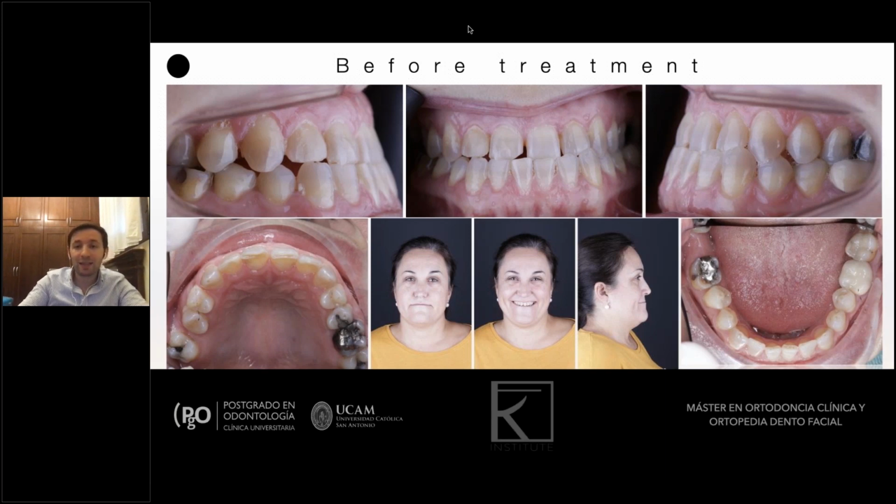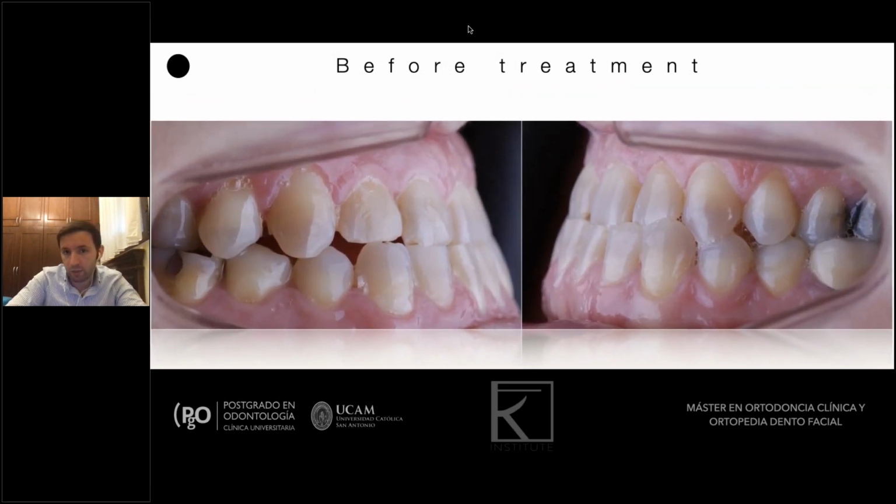We made the intraoral scan, and they said, Perry, I cannot put veneers here because I need an overjet. So it's impossible. In that situation, I called her and I said, okay, come to my office. I'm going to explain what we can do. It's not surgical, it's non-surgical, but it involves some skeletal anchorage. So it's a little bit surgical, okay?